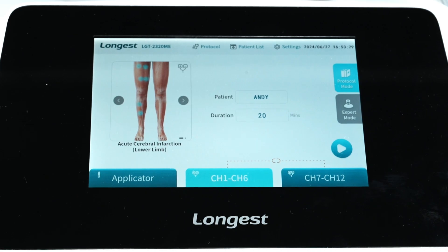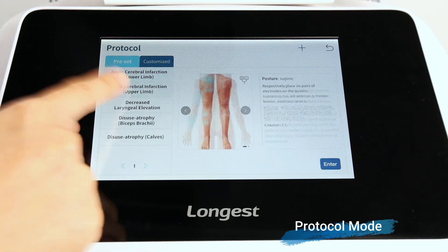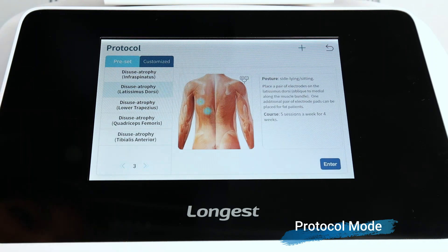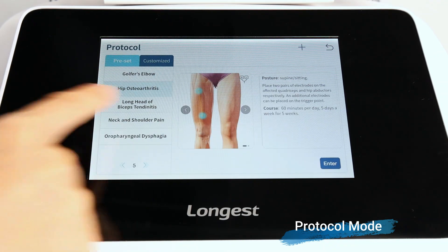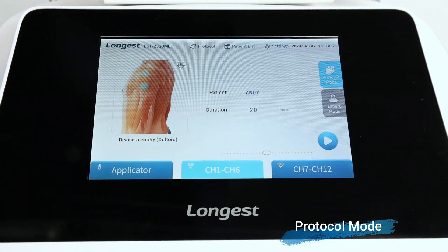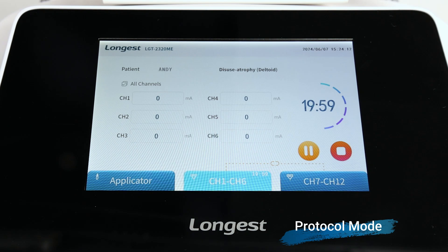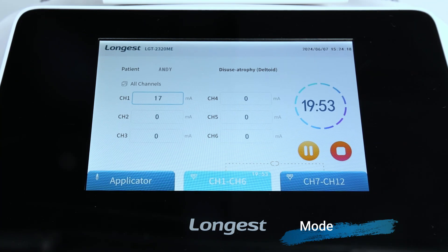There are two treatment modes: protocol mode and expert mode. In the protocol mode interface, click the body part image to enter the protocol library. You'll find a wide range of preset protocols designed for different body areas and goals. Each protocol comes with electrode placement guidance and treatment guidance — select a proper protocol according to the client's condition. Click enter to enter the duration setting interface. Click the start button to start the treatment, then click the intensity boxes and adjust the intensity using the rotary knob. Start with a low intensity, gradually increasing to a comfortable level.